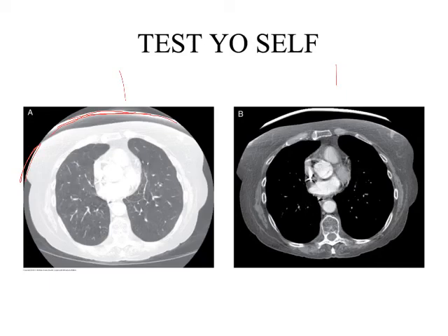But now, knowing all that we know about CT, we're going to have to think about how it has both some great power, but it also has some limitations, right? It also has quite a few limitations for us as radiation therapists. And this is probably one of the number one limitations of CT. And it goes back to that gantry aperture size, right? The bigger my gantry aperture is, the more I can sample without clipping anatomy, right? But if I'm working with a fairly small gantry setup, or I'm using a patient setup that pushes the patient too far away from the scan's isocenter, I am going to run the risk of clipping anatomy, okay?